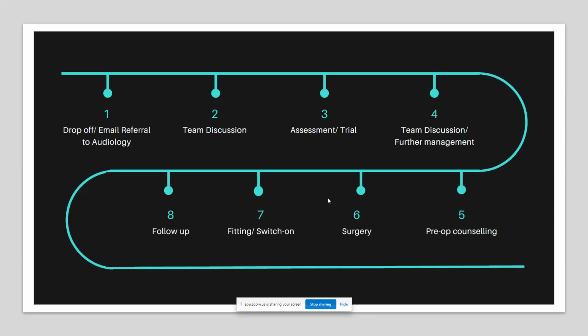In that trial period, it's for them to see if it actually works for them. Does it make a difference in their life and communication? We also look at how well they take care of the device during that time, and whether they are actually using the device during the trial period.